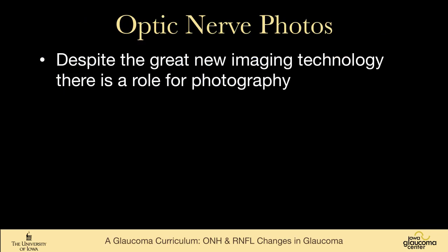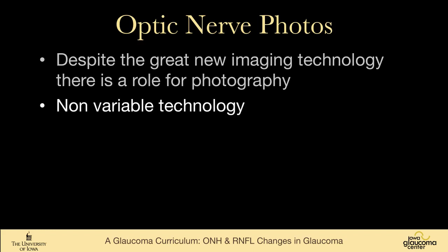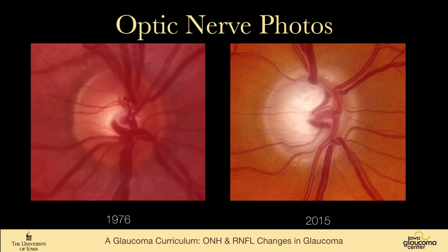So these imaging technologies are spectacular, and I definitely use them every day in my practice. But despite that, there's definitely a role for photography. It's non-variable technology. So I showed these pictures earlier. This is 39 years of follow-up. And just imagine what your 39-year-old retinal nerve fiber layer analyzer is going to look like 39 years from now. It's going to be pretty much useless to you because that technology will have gone through dozens of changes. But photography is photography. The one in 2015 taken with a digital camera, the one in 1976 taken with Kodachrome, but you can still compare them.